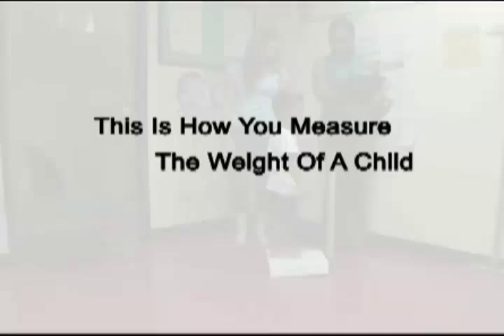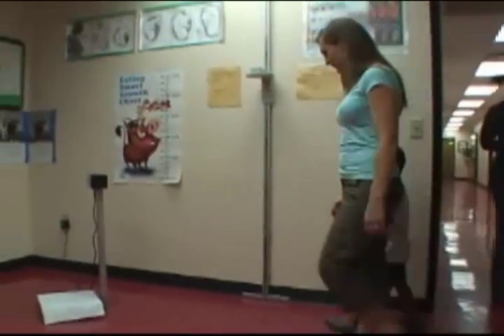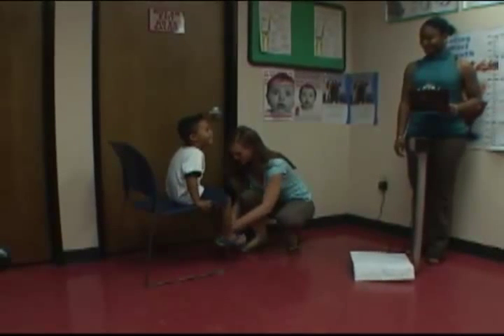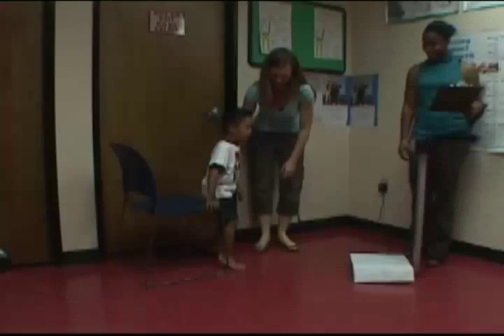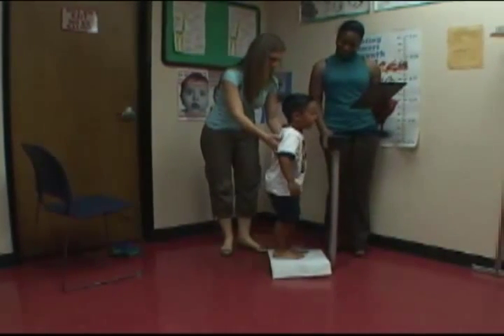This is how you measure the weight of a child or an adult using a digital scale. In this video, we'll be taking the weight of a four-year-old boy using an electronic scale. Before weighing, have the caregiver take off the child's shoes or any heavy clothing like jackets or sweaters that might affect the child's weight. Make sure that the scale is on and set to zero. Then have the child step onto the scale and remain still until the scale finishes adjusting, which is usually a couple of seconds.